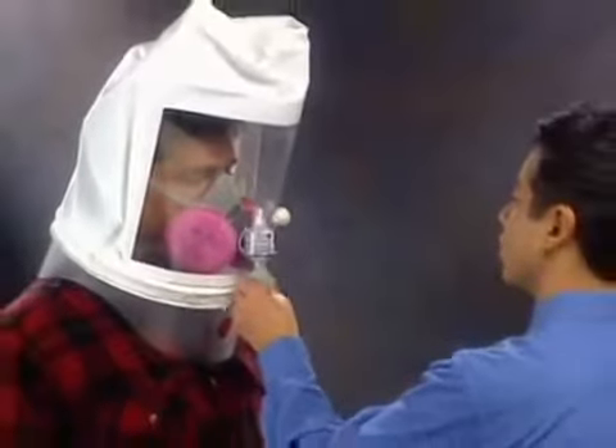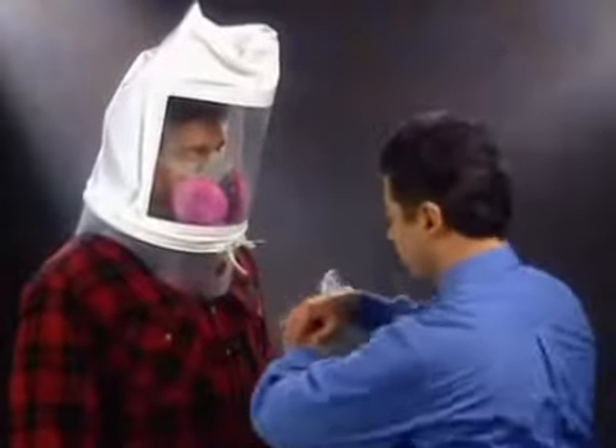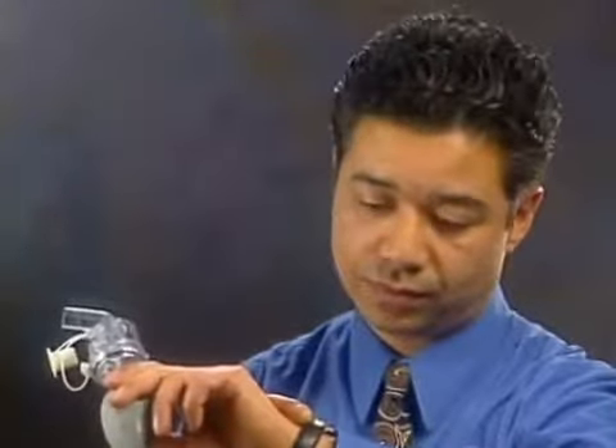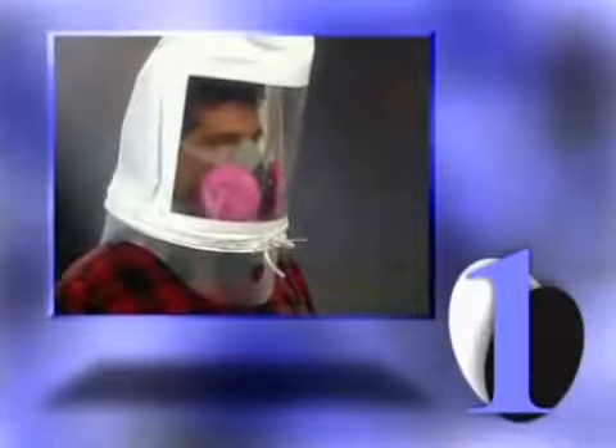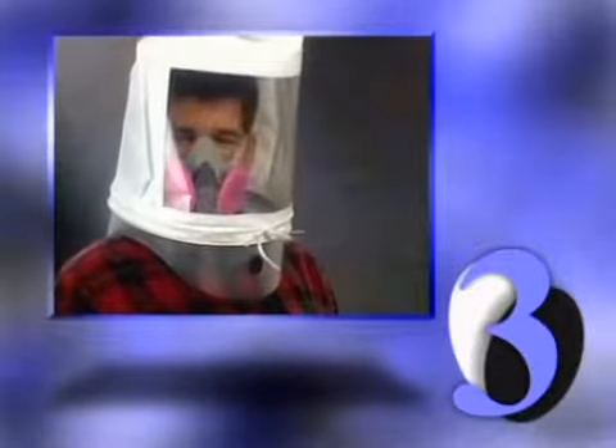Continue to breathe through your mouth during the entire test. Perform the following exercises for 60 seconds each, as directed by your instructor. 1. Breathe normally. 2. Breathe deeply and regularly. 3. Turn your head from side to side, stopping for a breath at each side.